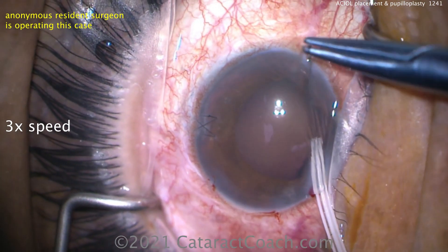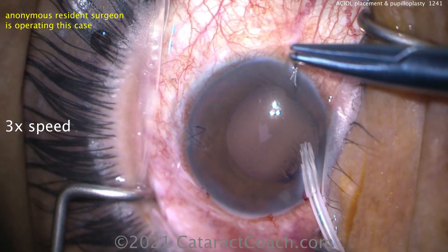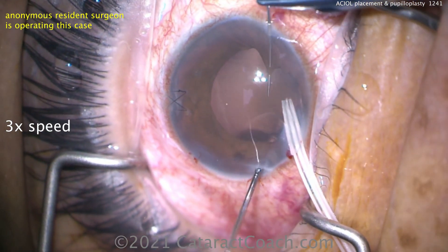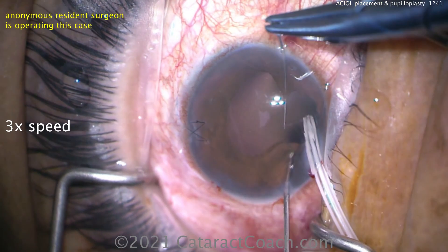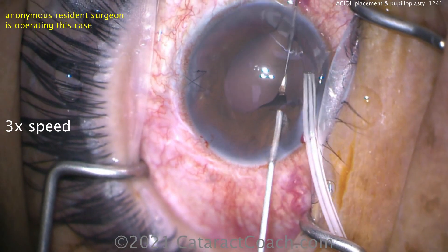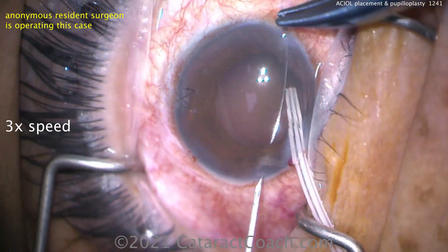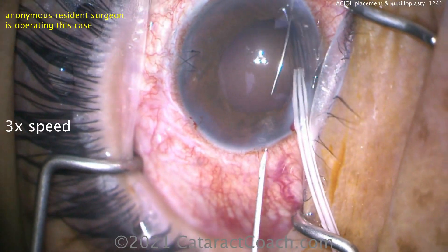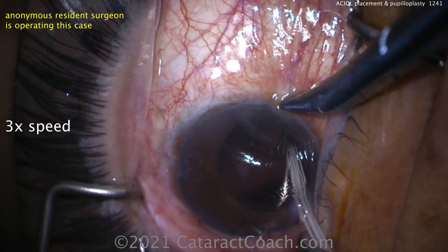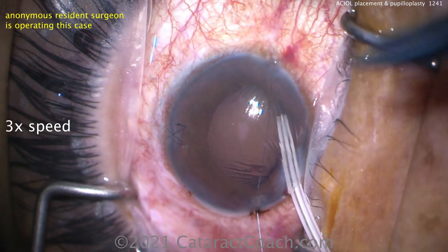There's that long curved needle getting a bit of the iris. Now this is the catch — how much iris do you grab? It's helpful to go ahead and use forceps in the other hand, or even a needle, and advance the tissue to you. Now we'll pass it through. The first bite on the iris is a little bit too close to the periphery. The second bite coming out now is pretty good. We use that hollow bore needle to dock it and bring that 10-0 proline needle out through that paracentesis.